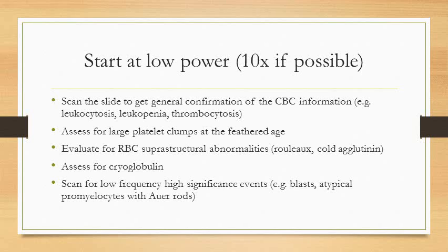And then at this point, you can start looking for specific things. First, assess for large platelet clumps at the feathered edge. Sometimes you can have really severe platelet clumps, so you really might not notice them inside the slide, but at low power, when you look at the feathered edge, they're really obvious.